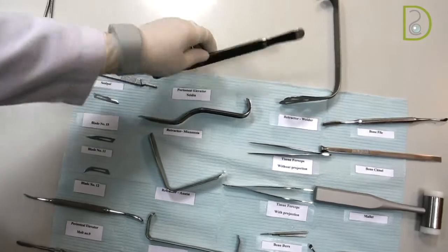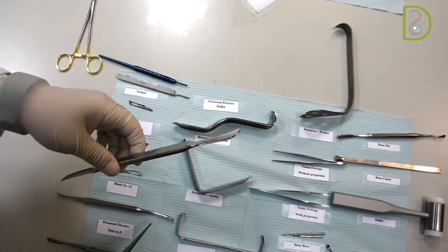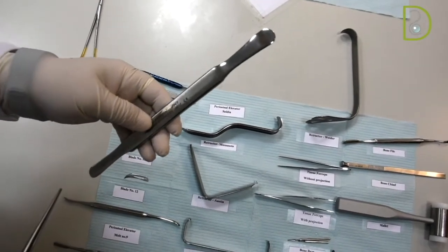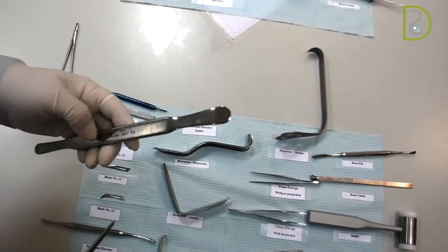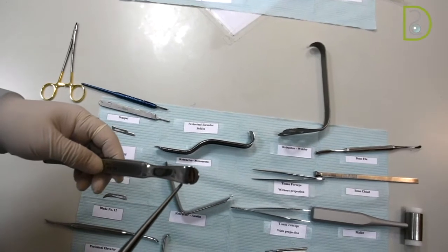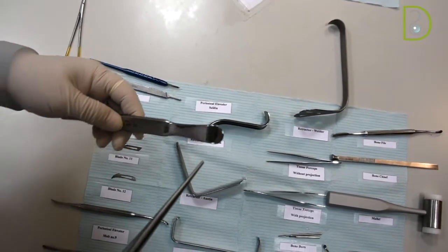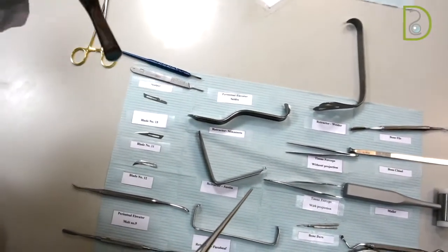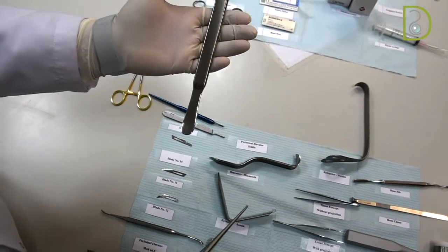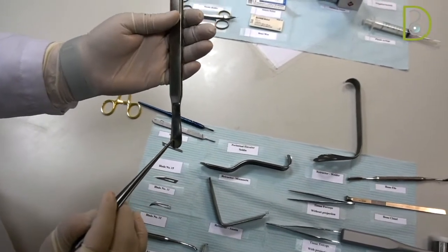This is Seldin. Seldin, as you can see, is very heavy, very strong. It has the same spoon shaped design as Molt number 9, with a bigger spoon on one side and a smaller spoon on the other side. But you can see that it is heavy and strong. So it's good in retracting the mucoperiosteum from all the alveolar ridge, let's say, for example, in alveoloplasty surgery. And at the same time, you can hold it and retract the tissue away. So it will serve two purposes, one of which is reflecting, the other is retracting.